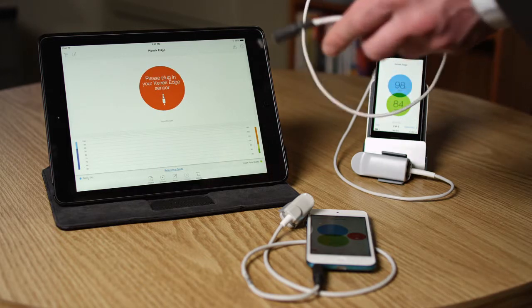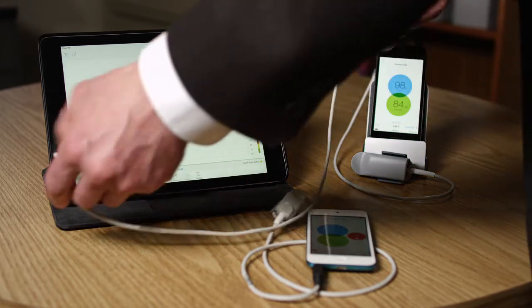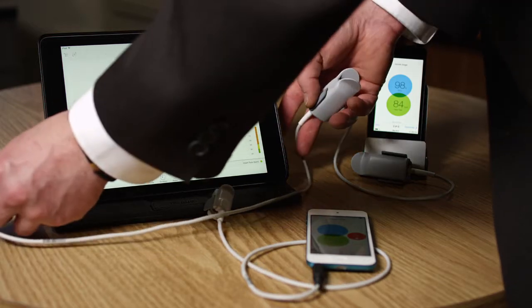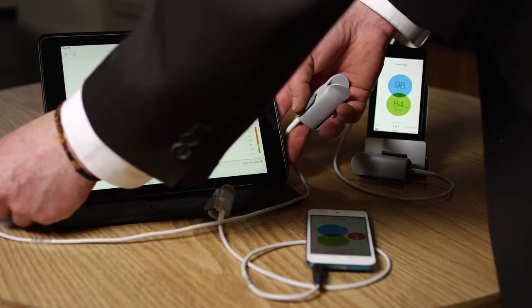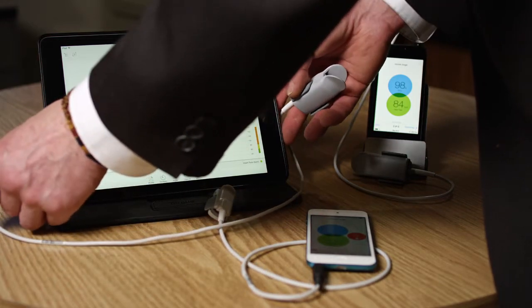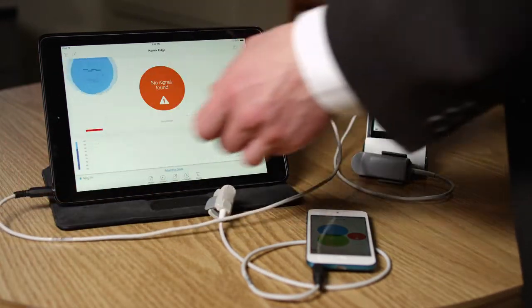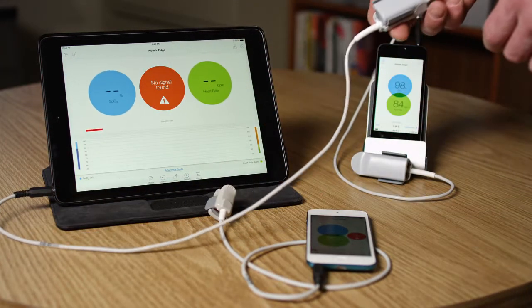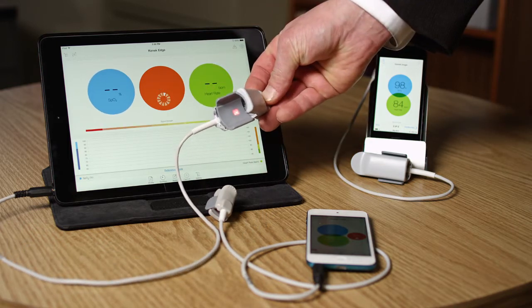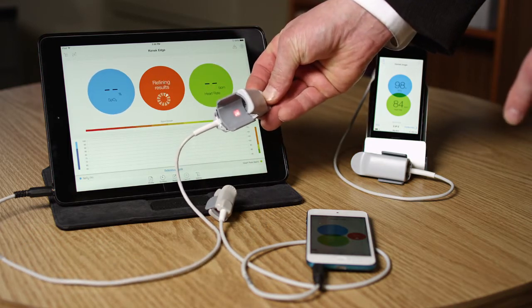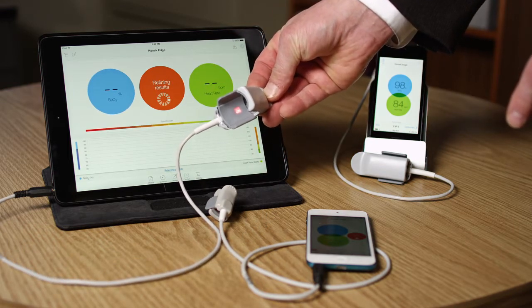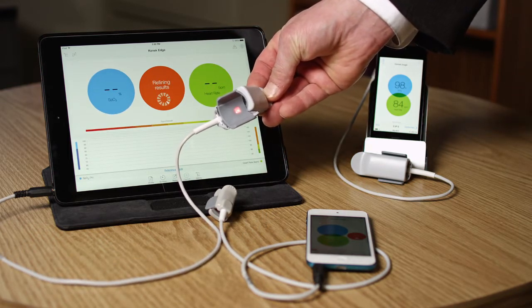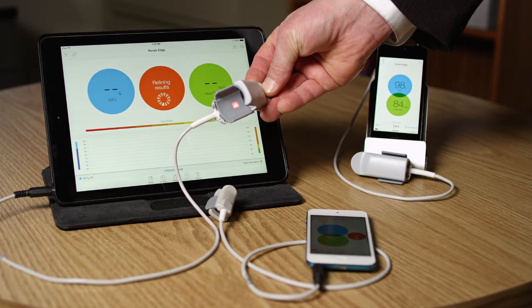If I plug in this sensor into the audio port of this iPad, it lights up. The audio signal from the iPad is actually driving this sensor.